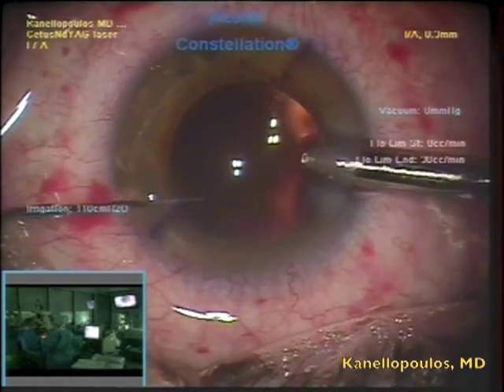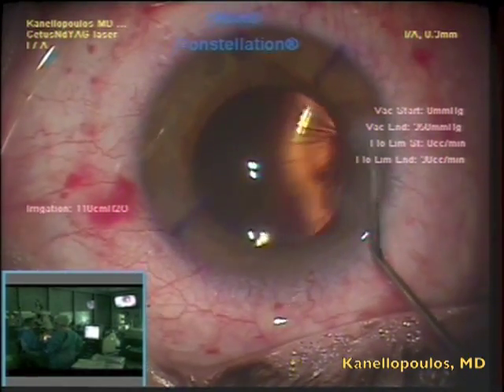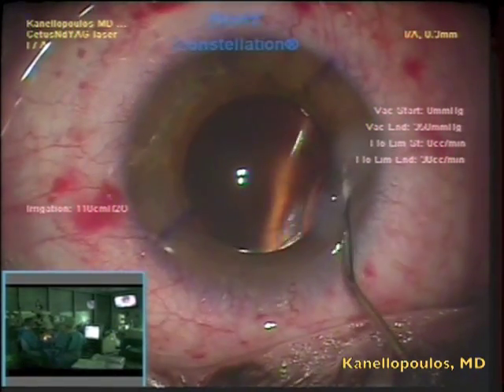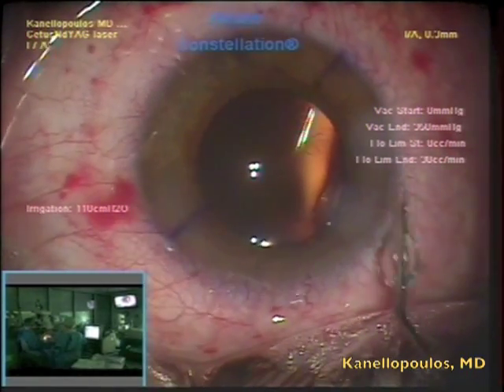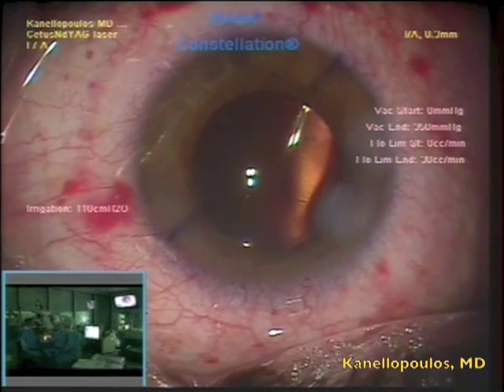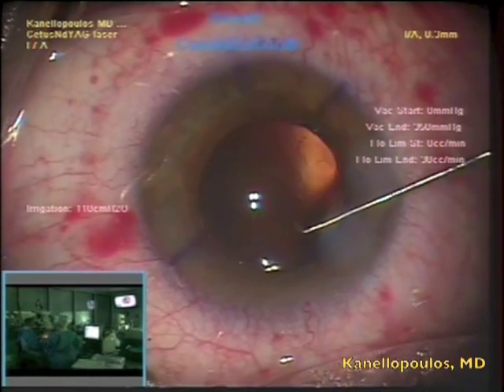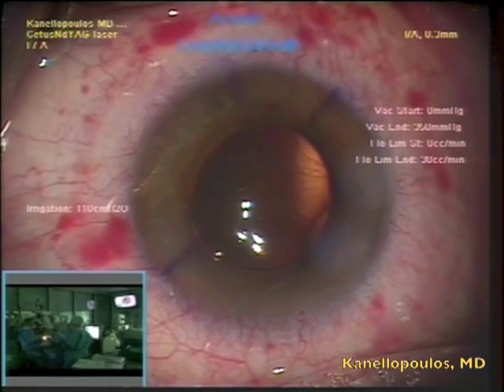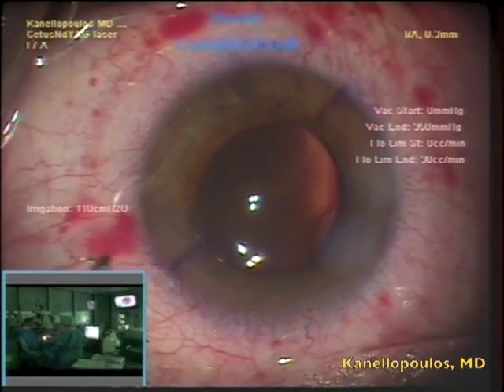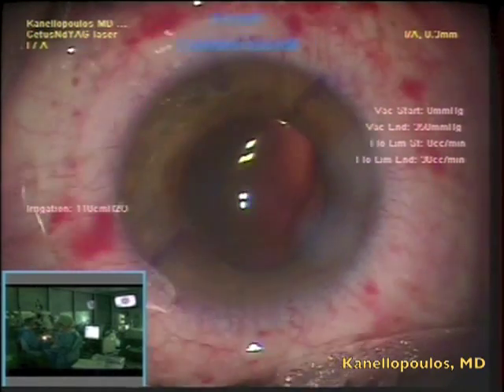As you saw, we've reversed the steps of the lens fragmentation and hydrodissection technique. We do first the lens fragmentation with viscoelastic — we introduced this technique at the American Academy of Ophthalmology meeting in Chicago 2012 at the LensX User meeting. Here we're using fluid to attain wound closure. After lens fragmentation is performed with viscoelastic, as it has been pre-dissected with the femtosecond laser, we then perform a hydrodissection in order to pop one of the segments of the cataract into the anterior chamber and make the procedure extremely easier. I'm fine-tuning the position of the toric lens and refilling the anterior chamber with fluid to attain a stable and watertight procedure. Thank you very much for your attention. This is John Canalopoulos signing off from Athens, Greece.